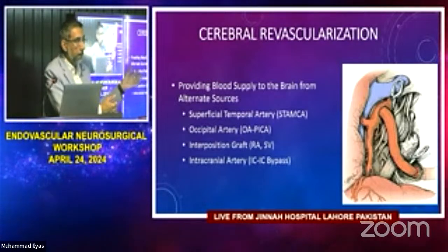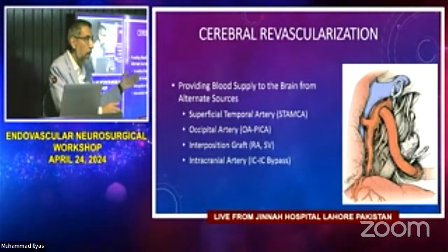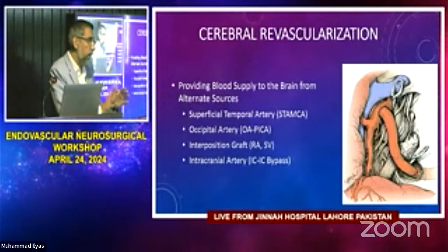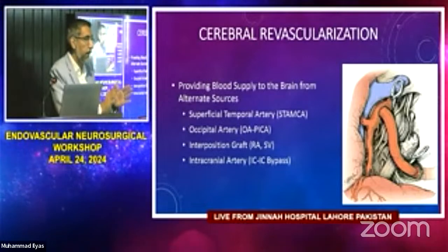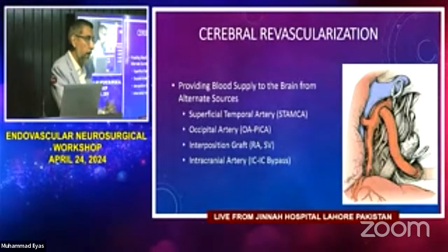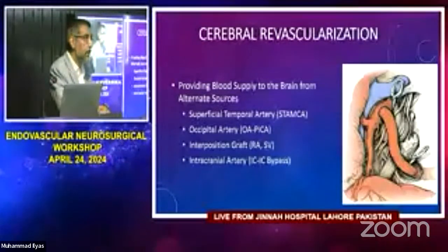In the cavernous segment, you don't have any critical branches, right? For a CCF, you have to close the hole. That works perfectly, because it's a covered stent and blood cannot get through it. You just put it in once, it shuts it down and you're done. But the patient needs to be on dual antiplatelets for about 6 months.